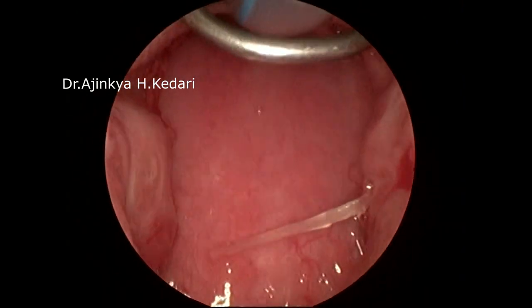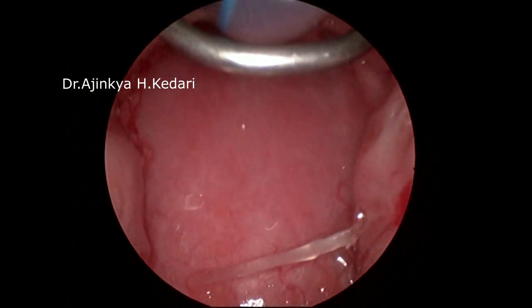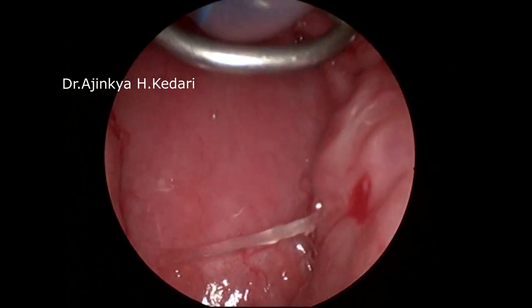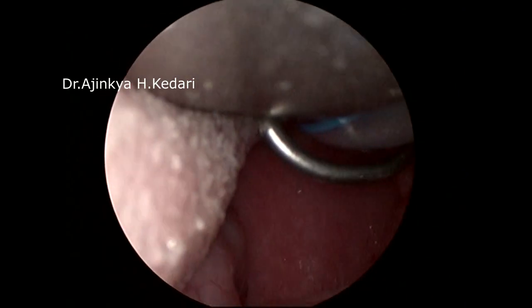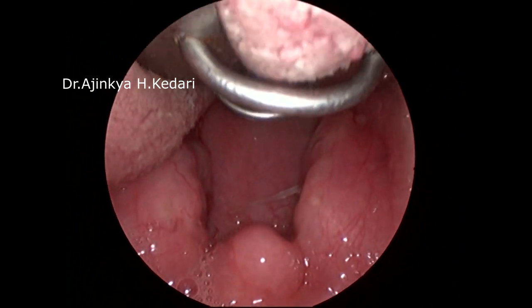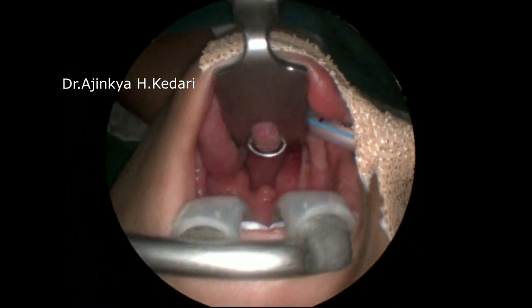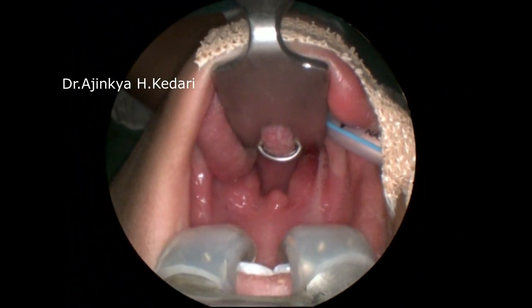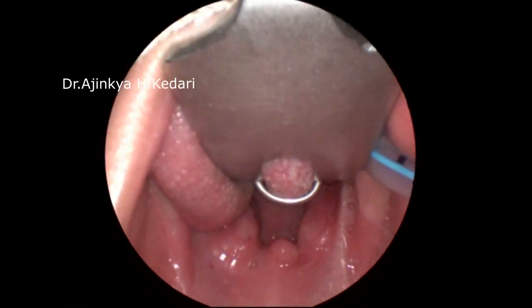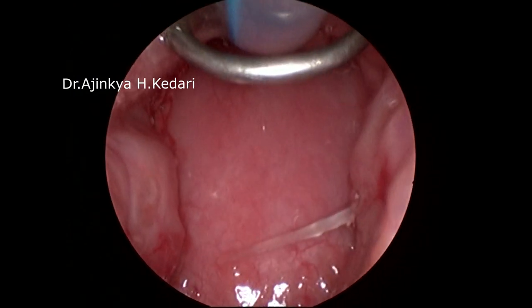being a very small kid — this kid is two years of age — he is never going to cooperate. And this can lead to the entry of the fish bone into a secondary area, which could lead to even more serious complications. So the best way to avoid that is to take the patient under GA. As you can see, the area for surgical exposure is excellent with a secured Boyle Davis mouth gag.